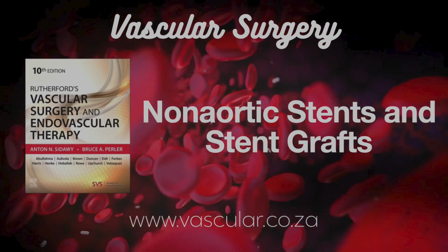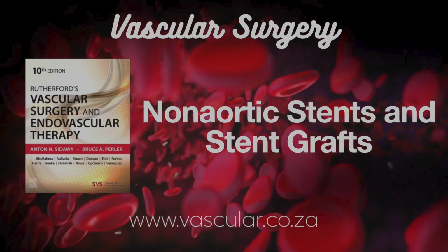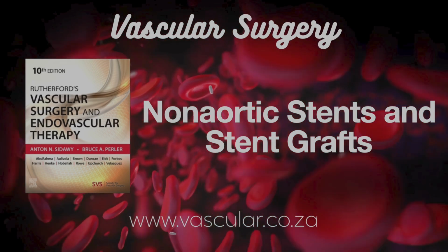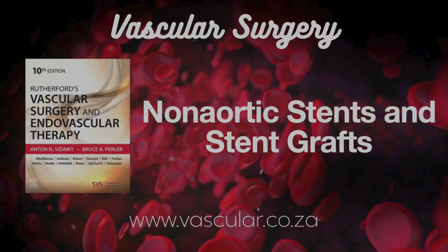Covered stents useful here? Potentially, yeah. Since the main problem is tissue overgrowth, stent grafts are a reasonable choice, especially if the vein gets damaged during angioplasty. Some studies show they outperform bare metal stents for certain blockages, particularly right where an artificial graft connects to the vein. Okay, a lot depends on the exact spot.